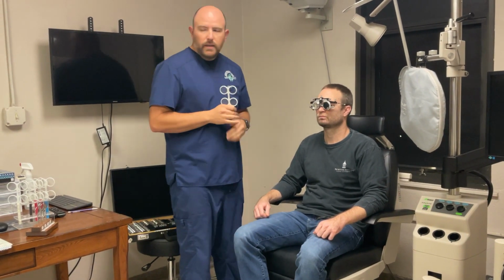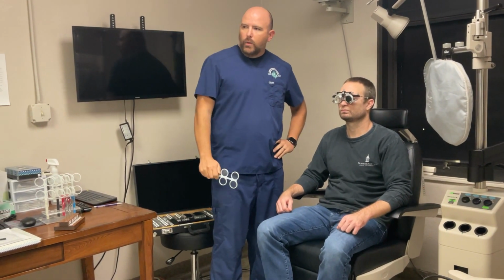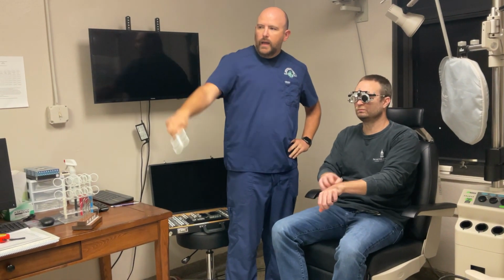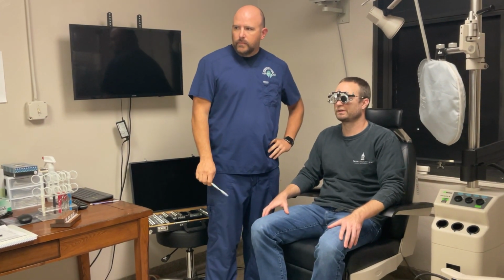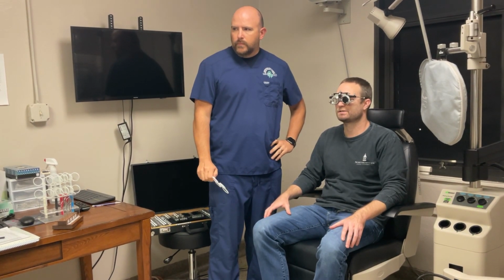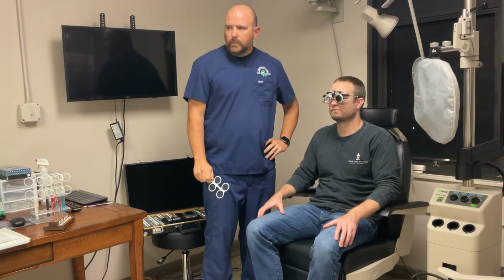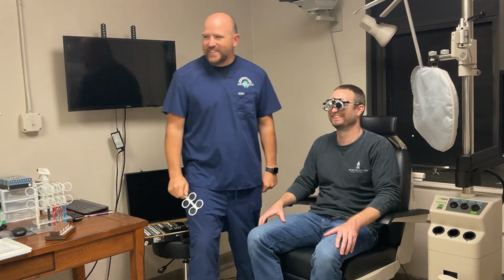We're going to check VAs. Now, Drew, I want you to look up there and go ahead and start at that NVSOK and read as low as you can for me. NVSOK, DRZKO, SNHCV, CRVSZ. All right, and I think that's going to be good enough for the purposes of the proficiency.